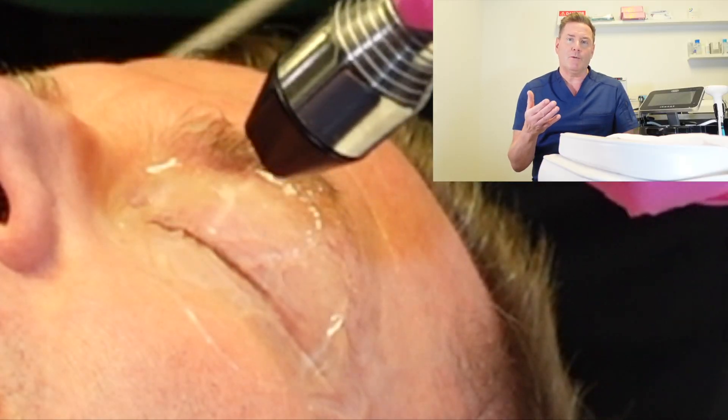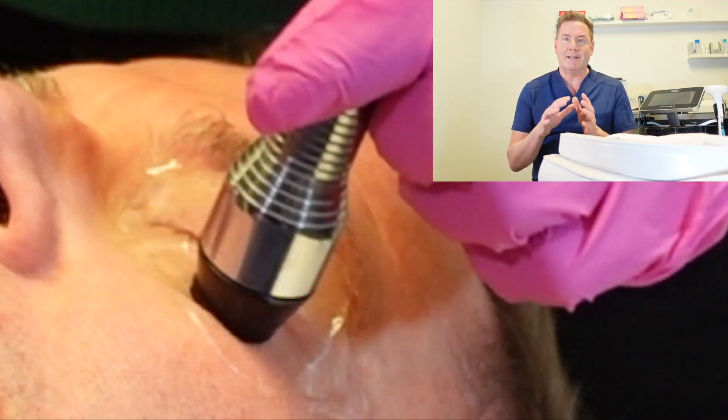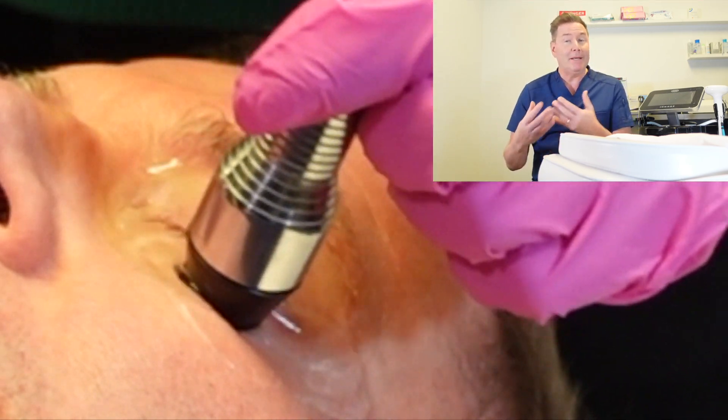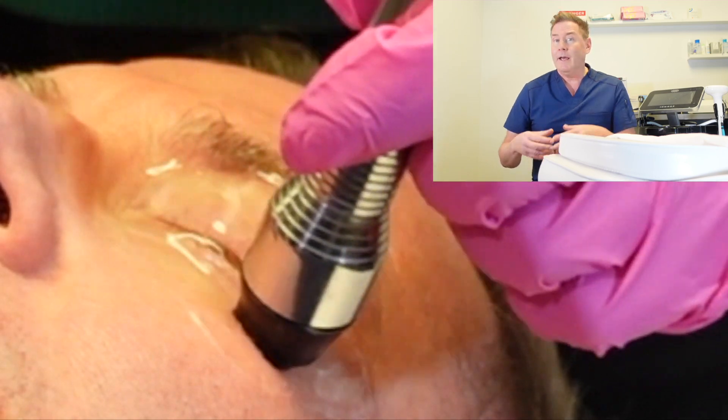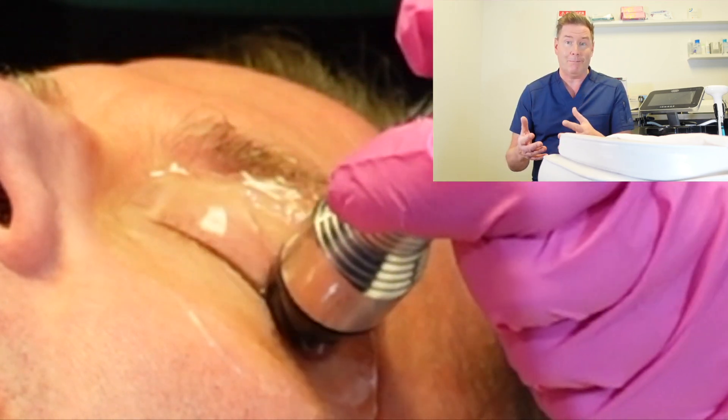Next, the ocular hygienist will put some ultrasonic gel onto your eyelids to reduce the friction from the probe gliding over your eyelids. Because this gel is inert, if you happen to open your eyes or get any in your eyes it's not going to irritate, sting, or burn in any way.